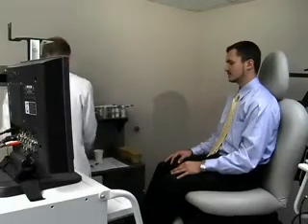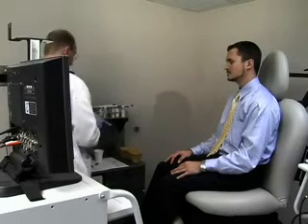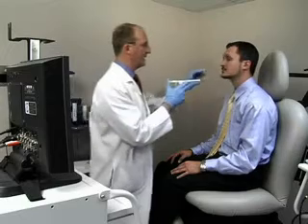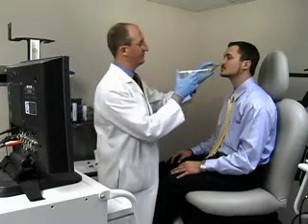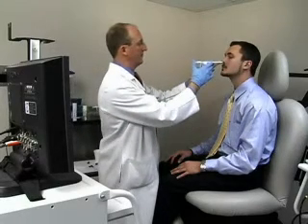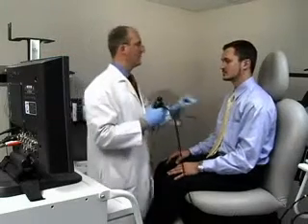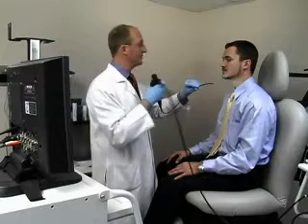Ascertain the patient's medical allergies and medical contraindications prior to the administration of any anesthetic or decongestant. Once the nose is adequately prepared, the procedure may begin. The patient is comfortably seated upright, again facing the examiner with his or her face at eye level.